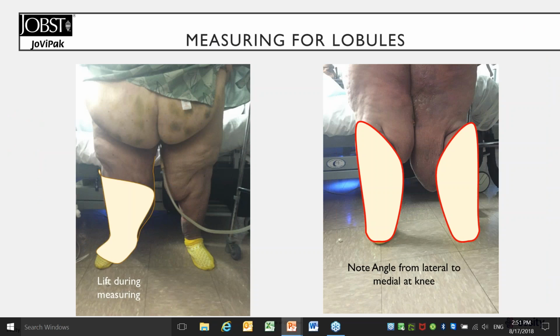Here we go. The first outline here is, if you will, consider this a garment that is in place. The tissue is slightly lifted in this, as you might see, because we took a firmer circumference around that area that was soft, and it allows for the tissue to be slightly lifted in that garment.